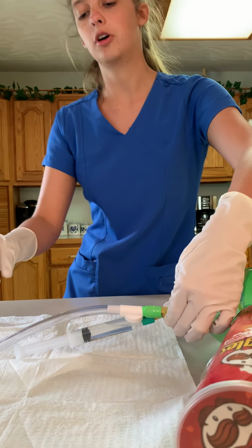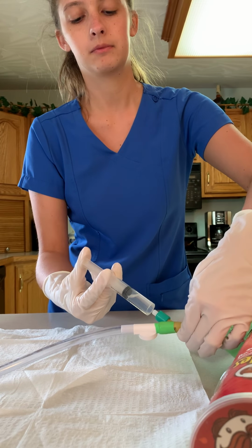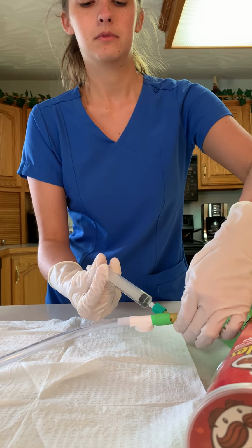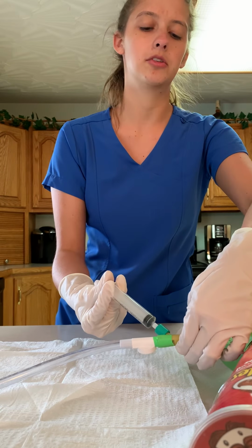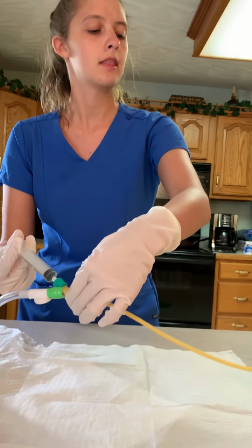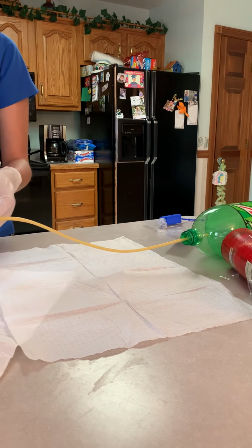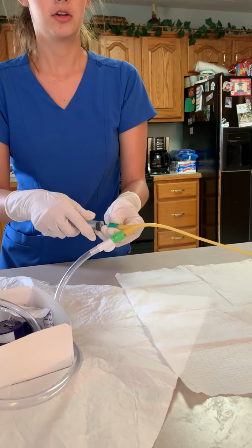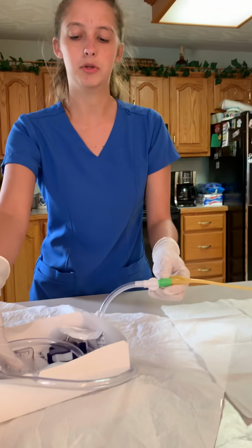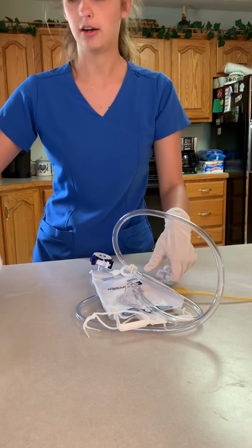Okay, so now that we are all the way up to the Y bifurcation, I am now going to stabilize with my non-dominant hand, and I'm now going to inflate the balloon. Okay, and now that our balloon is inflated, we're going to pull all in one motion to the foot of the bed. And our balloon caught now, so we can unscrew our syringe, and we're going to go out and away. And I can now remove the bag and lay that on the bed.